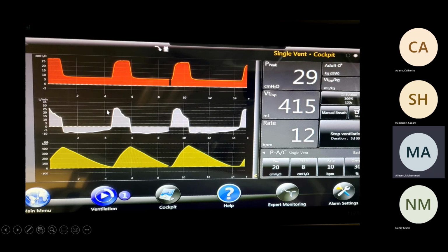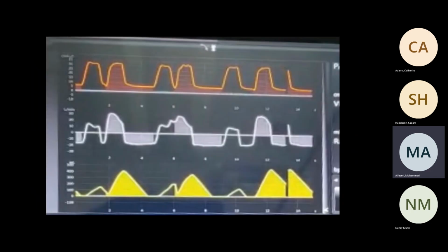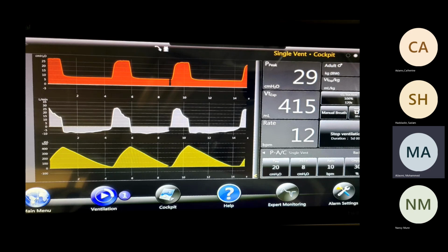We did not see that a breath was started by the machine. In this one, the respiratory rate was 24 or something. So the machine will time the breath, and the patient decides he needs a breath right now, but it will be supported by the machine. We decreased the rate, that's what happened. However, I'm still expecting the flow will be like this.